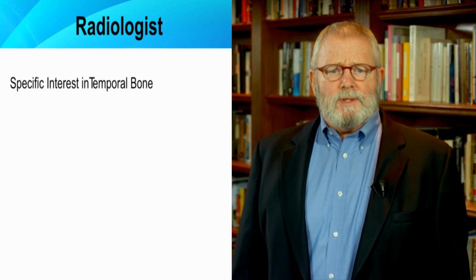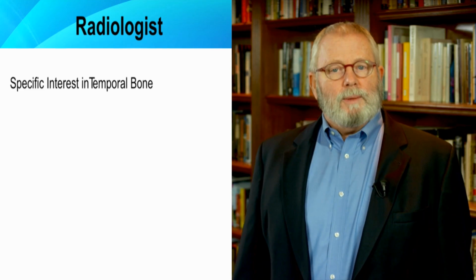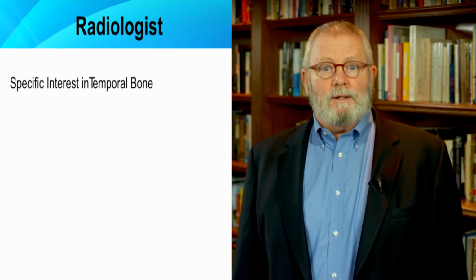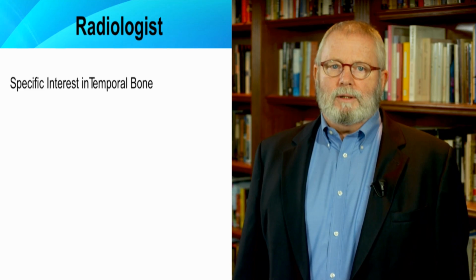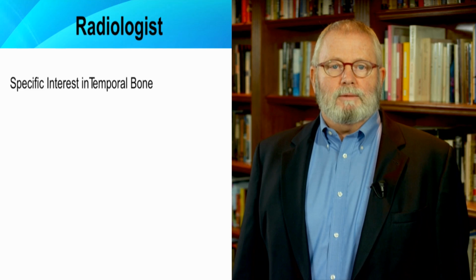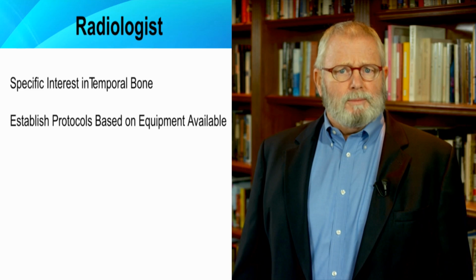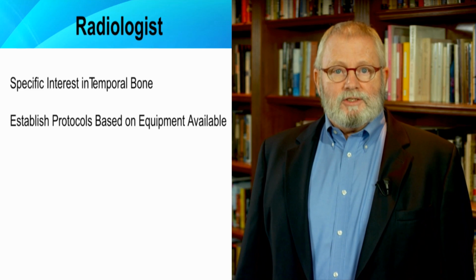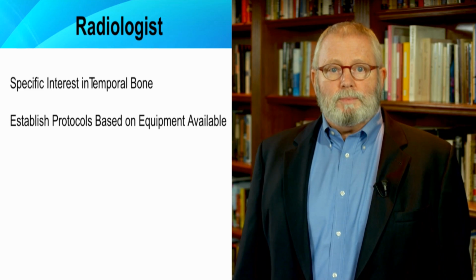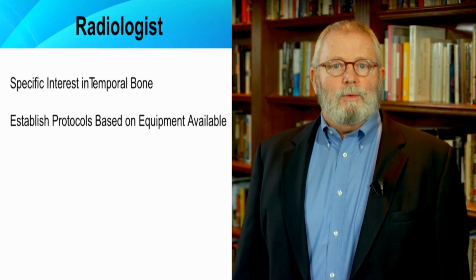A radiologist with a specific interest in temporal bone imaging and cochlear implantation will understand the clinician's needs. For example, they will recognize that contrast is not needed for either MR or CT scanning, and that reconstructive sagittal imaging is an essential part when evaluating a potential cochlear implant recipient. Moreover, a variety of hardware is available from different manufacturers. Different hardware will use different imaging protocols, and an experienced radiologist can determine which protocols and sequences are best based on the clinician's needs and the equipment available.